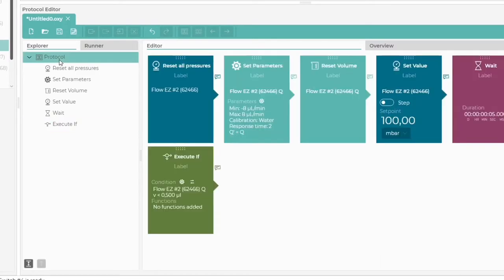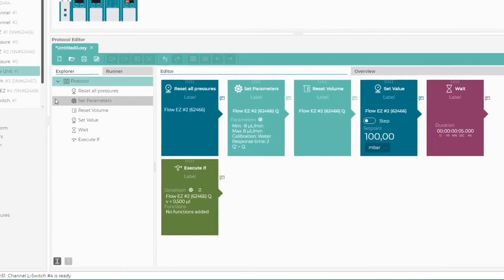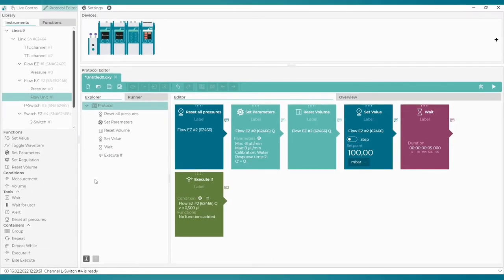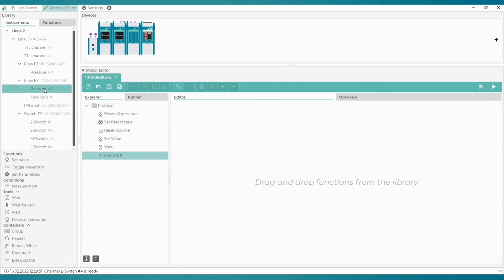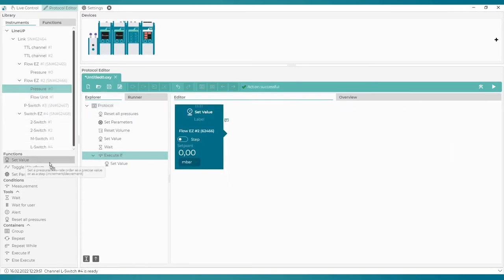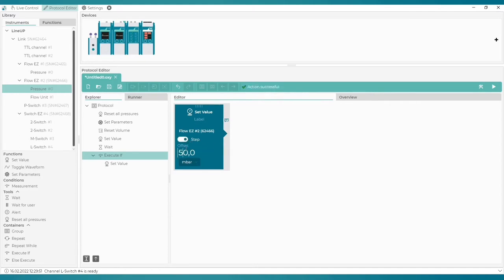From here, we can go back to work with the main protocol. Once again, we go back to the block Execute If. Here we simply select the Set Value function, activate Step Mode and type in 50 millibar. This means that the previous pressure value will be increased by 50 millibar.